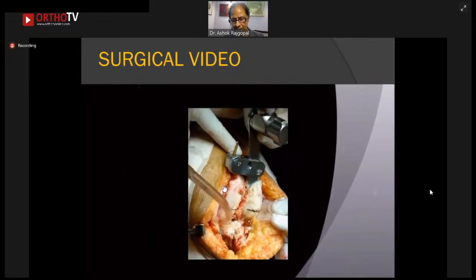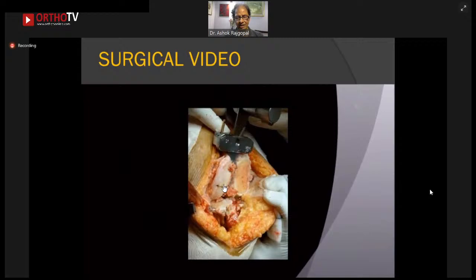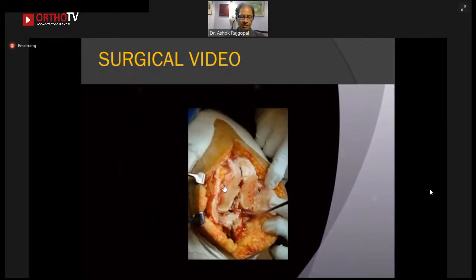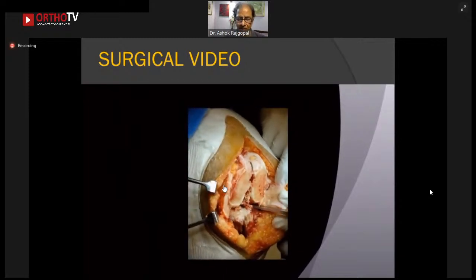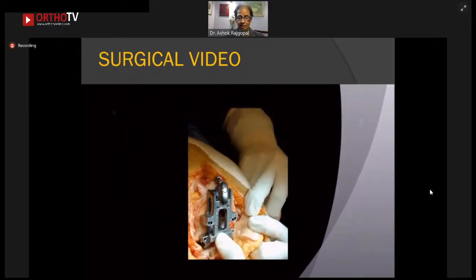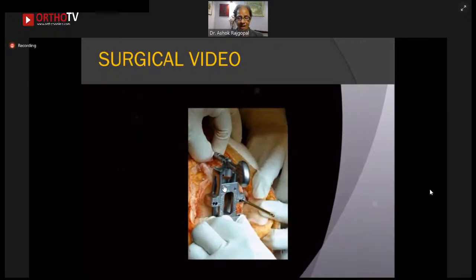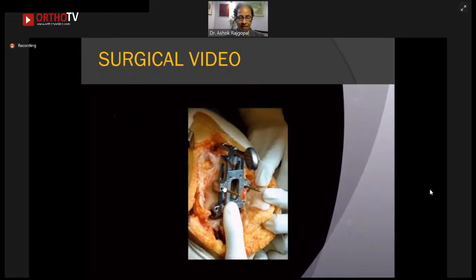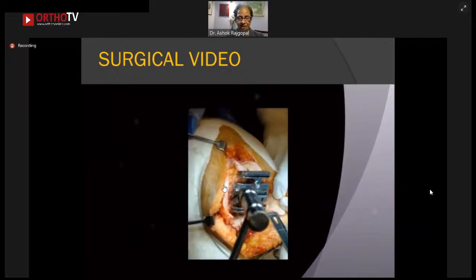You take down about 9 millimeters from the distal femur. So this system takes out equal amounts of bone from the distal and posterior femurs, 9 millimeters both sides. This is your sizing guide. Again, this is fundamentally an anterior instrumentation system.